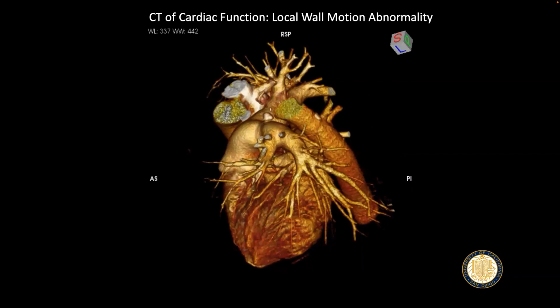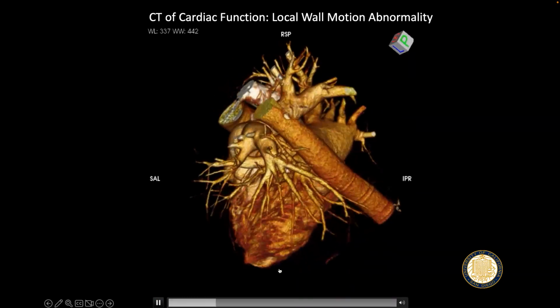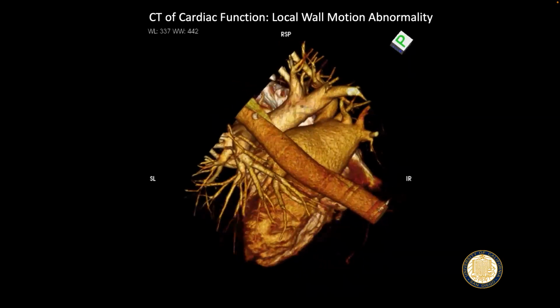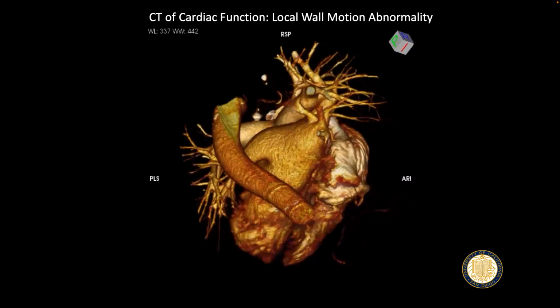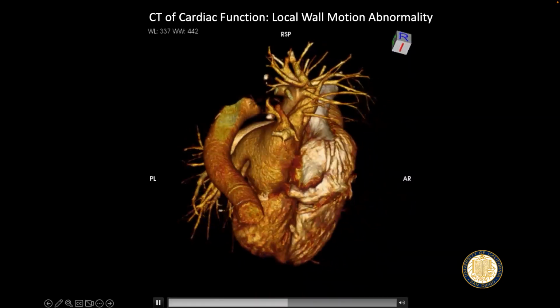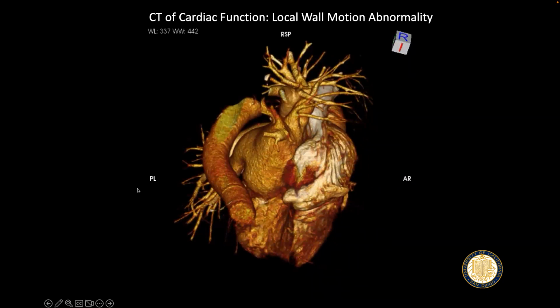Too much stuff. So what we did was we trained a neural net on these movies. This movie is like 50K, right? Because it's an MPEG movie. And so you basically train a neural network to detect this ball that isn't contracting, and it did a great job. It just became the human observer watching the movie and says, oh yeah, this movie, that thing's wrong, right? And so you don't have to have the voxels, you just have to have a rendering that shows the abnormality directly. And it's pretty cool. It worked great.